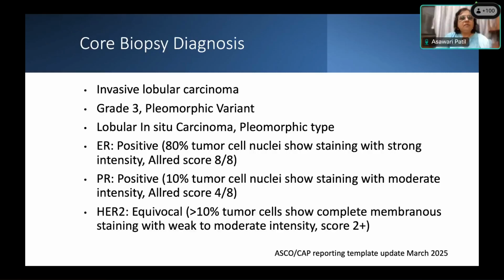I think you have covered everything, Ayushi. What I would just want this resident to approach, as Dr. Ayushi has said, is to start with the scanner. You say whether it is breast tissue. Do you think there is any abnormality suspicious for malignancy? Then go for higher magnification. So I think the description by Sarita was good.